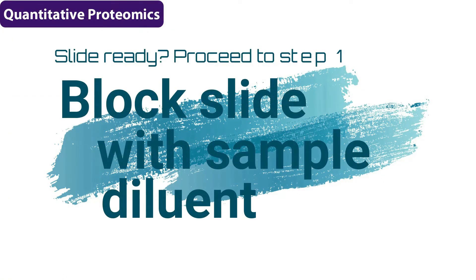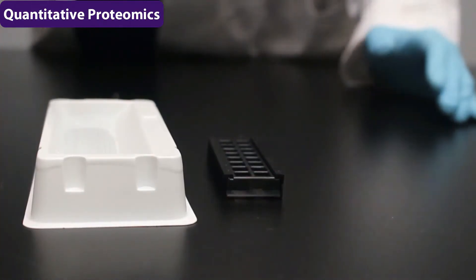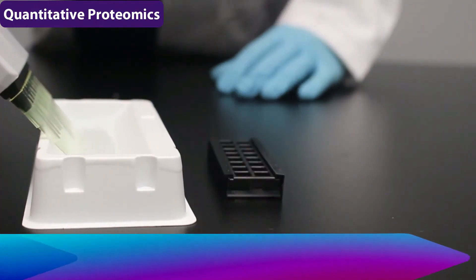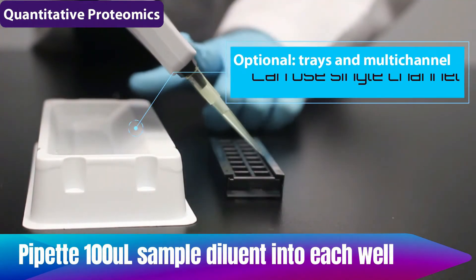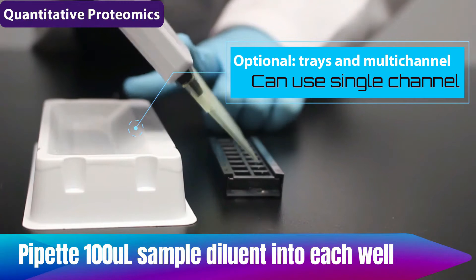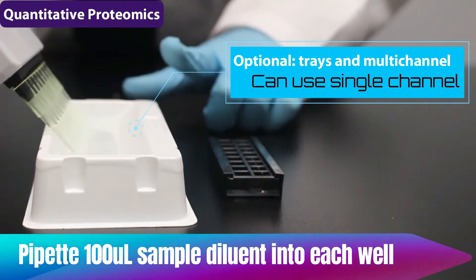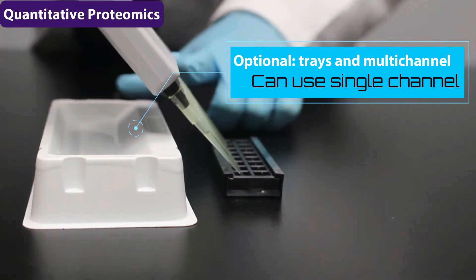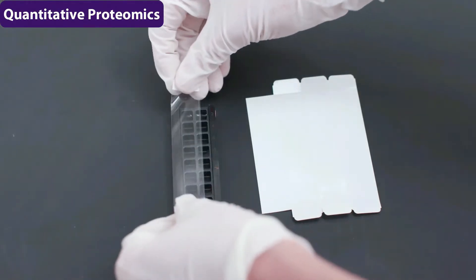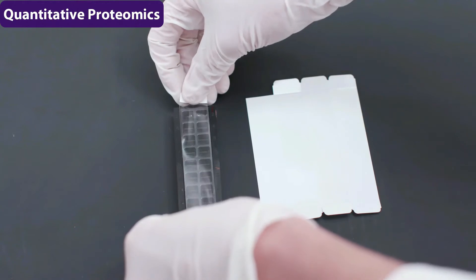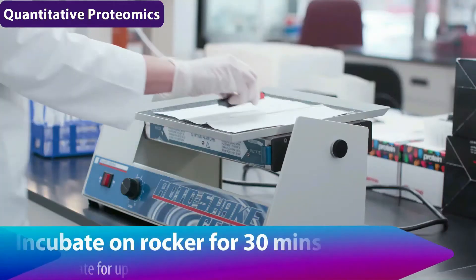If your slide is ready, you are ready to proceed to step one. Block slide with sample diluent. Every place on that slide that does not have an antibody is going to be blocked with this diluent, and that's going to prevent external contamination. Using a multi-channel, pipette 100 microliters of sample diluent into each well. Cover with adhesive film and incubate on the rocker for 30 minutes. Now this can incubate for up to two hours.